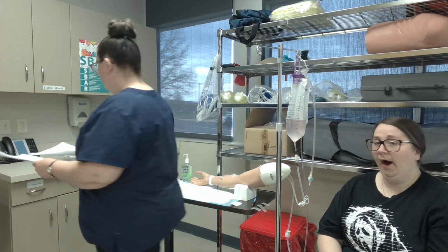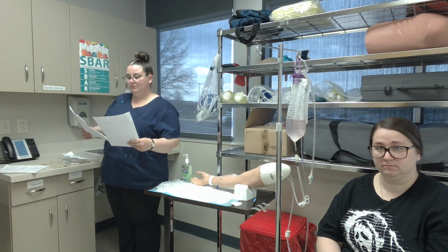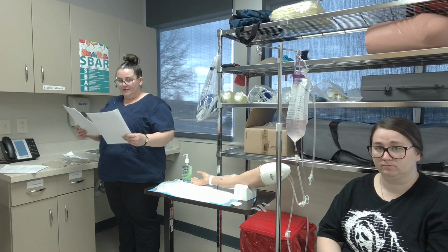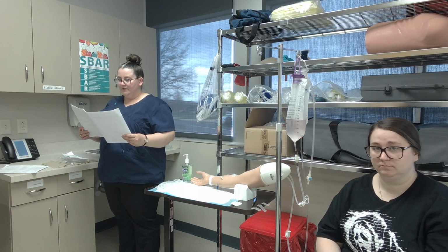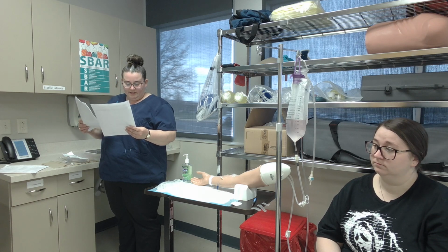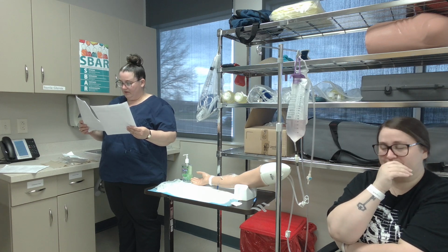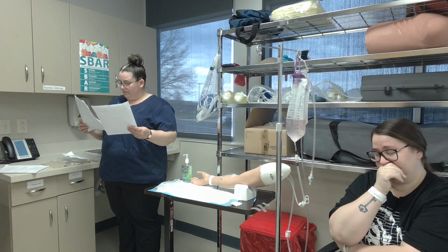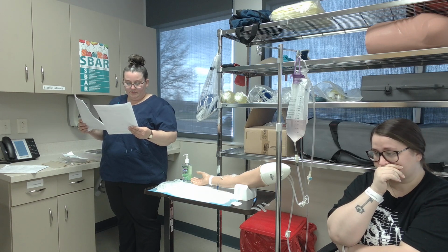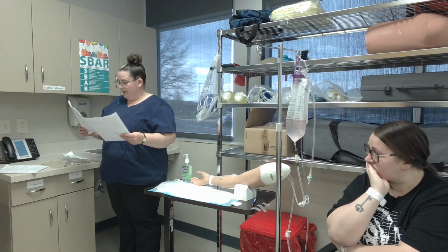All right, so I'm going back to my med cart. I have my hospital orders and my MAR, and I'm going to compare. So I have Mr. Joseph Smith, 10/5/1954. 0.9% normal saline. Infuse 1000 ml IV continuous for fluid balance. Status is active, and this med has not yet been given. I will be giving it at 10:45 a.m.